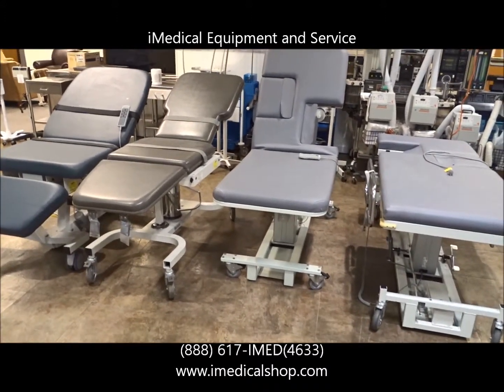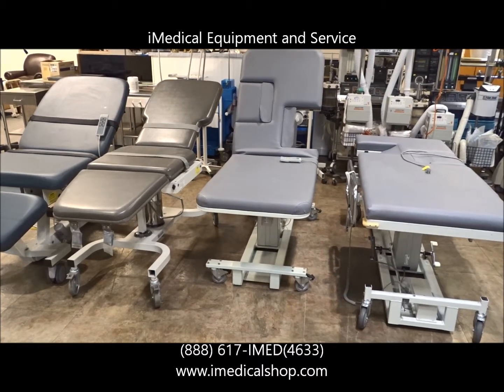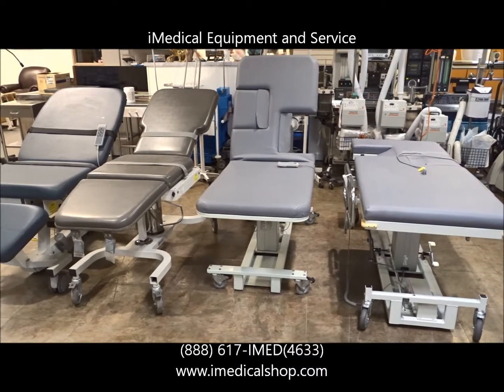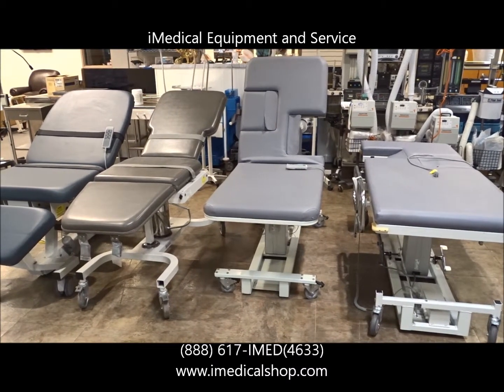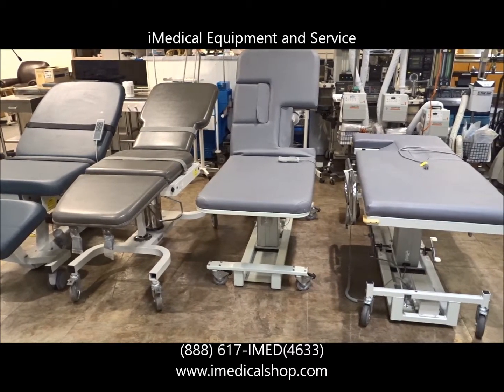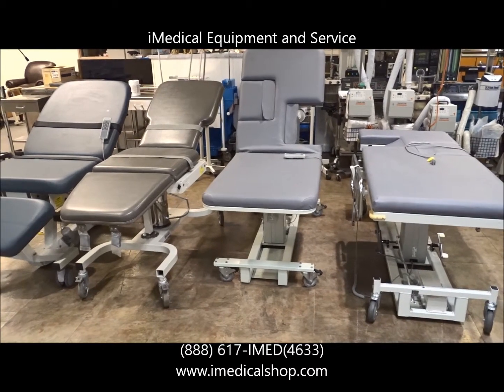Ultrasound tables, when we sell them, are going to come with a one-year parts warranty. We sell them from various locations in the United States — iMedical right now in Richmond, Virginia; San Diego, California; soon-to-be Cleveland, Ohio; and other locations opening up here soon.